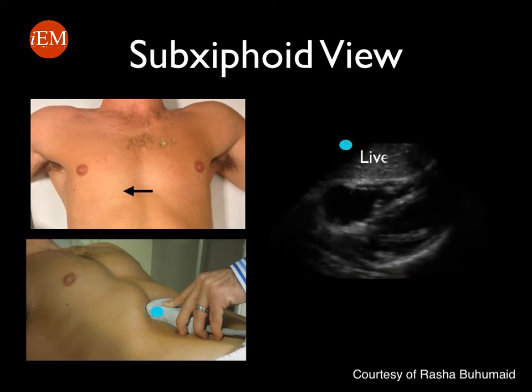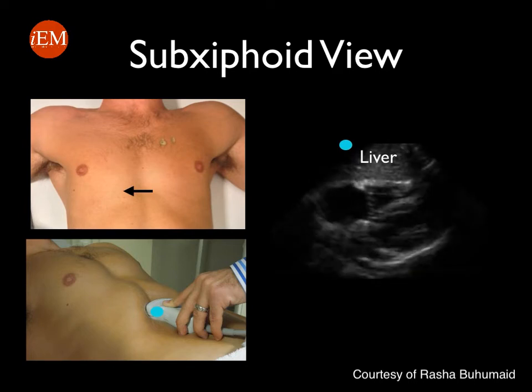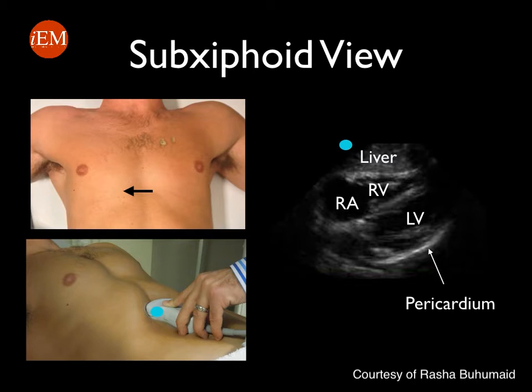This is the ultrasound image corresponding to this view — this is how a normal sub-xiphoid view will appear. The first chamber close to the liver is the right ventricle, and there is the left ventricle and the pericardium, which is noted as the white stripe surrounding the heart.